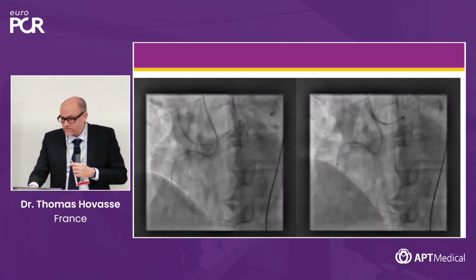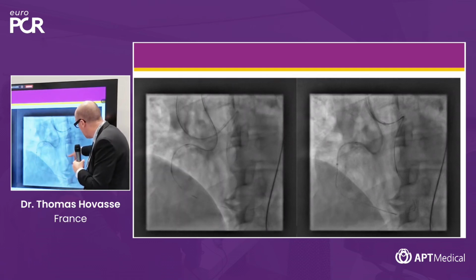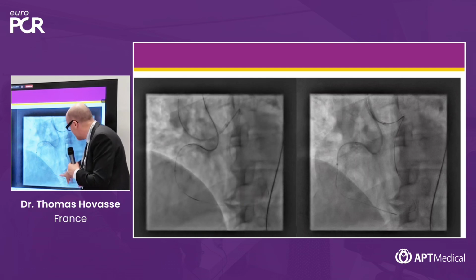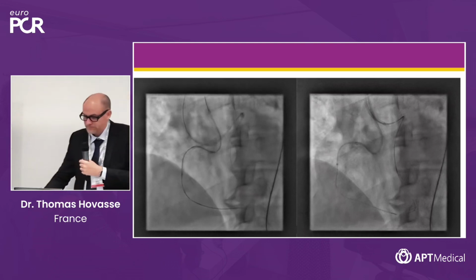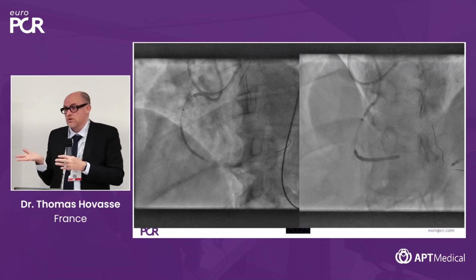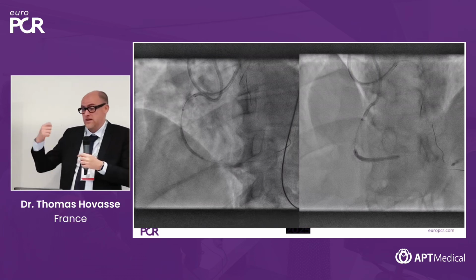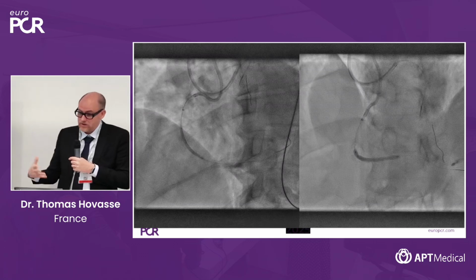And you see now we remove the retrograde microcatheter, we advance the antegrade microcatheter, and we are in the distal true lumen, and we can finish the case without externalization, with the antegrade wire only. Yes, that's the beauty of the tip-in technique. You don't need to externalize. You just have to advance the antegrade microcatheter on the retrograde wire, and it's working very well.